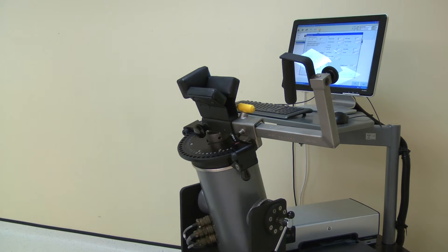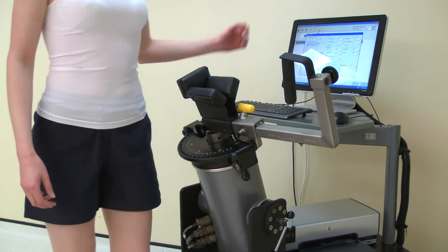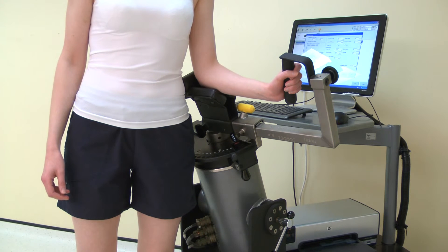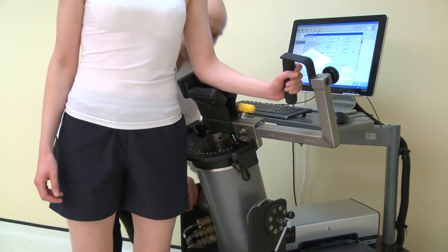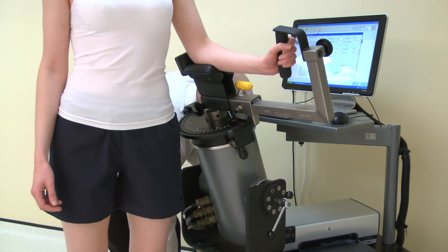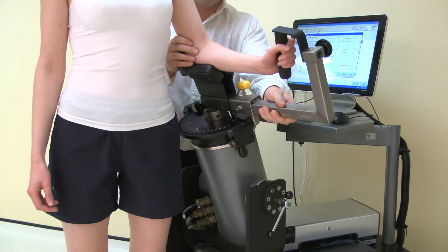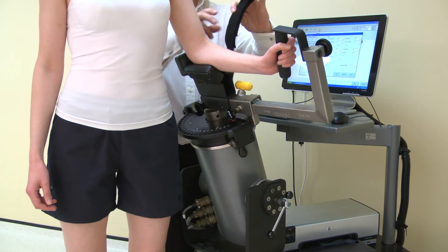Once the norm is positioned, ask the subject to stand next to the dynamometer. Place the elbow into the stabilizer. Then adjust the dynamometer height to ensure the shoulder is in a neutral position — that means not elevated or depressed. Now position the hand grip. Loosen the screw and slide to a comfortable position for the subject. Secure using the screw.